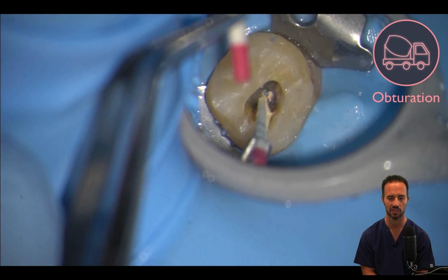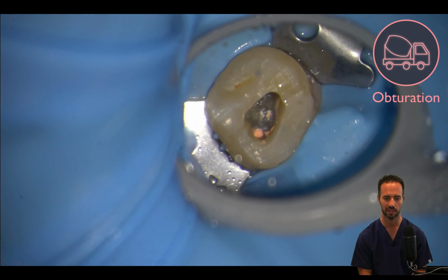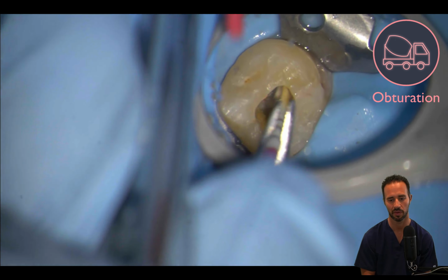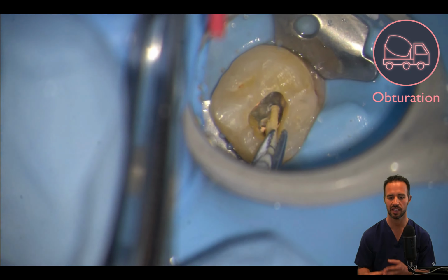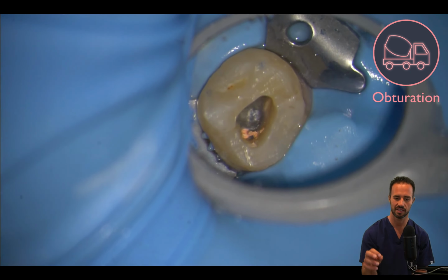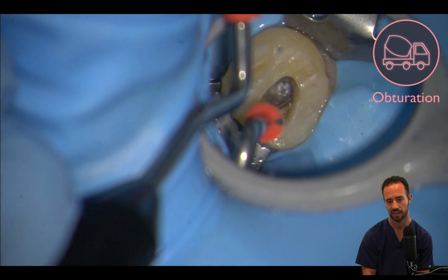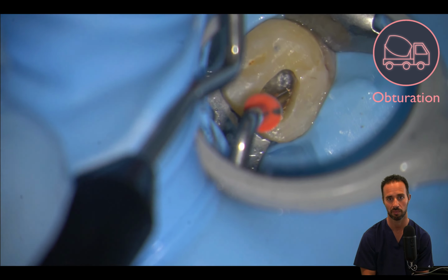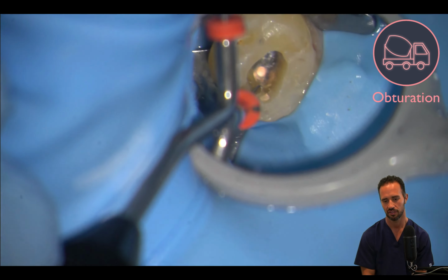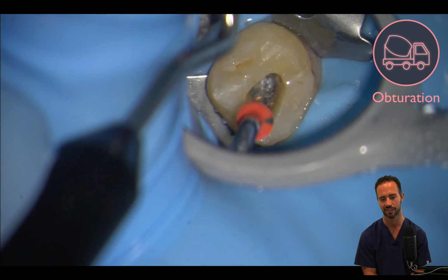So in this case, I'm actually using a paper point to try to flake off that gutta percha in the MB2 area. One of the reasons that that's so important is because if you think about it, if this case ever needs to be retreated and a provider sees gutta percha in the MB2 area, they're going to think that that goes all the way to an apex, and they're going to start prepping in that area and potentially perforating that. So, just fill what you've discovered. Don't kid yourself and start filling gutta percha where there was no canal found.